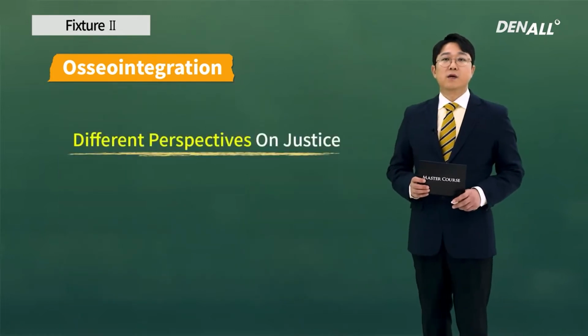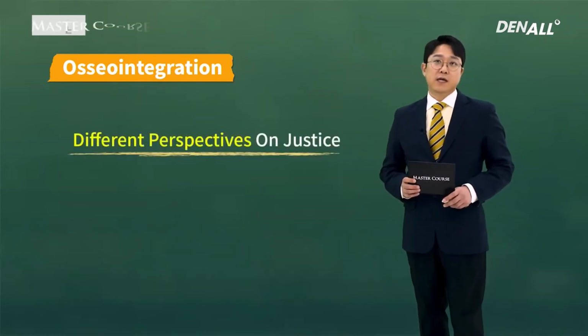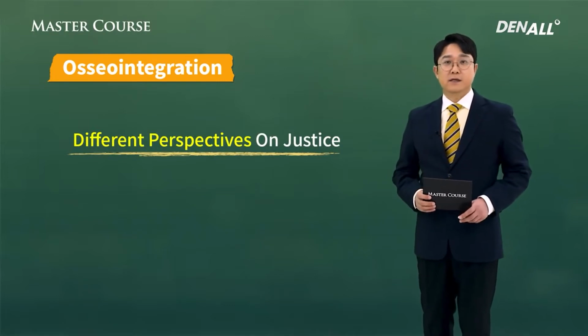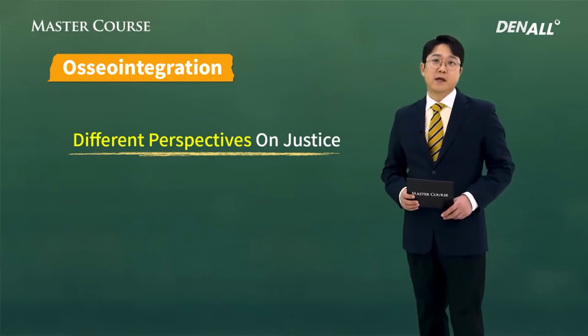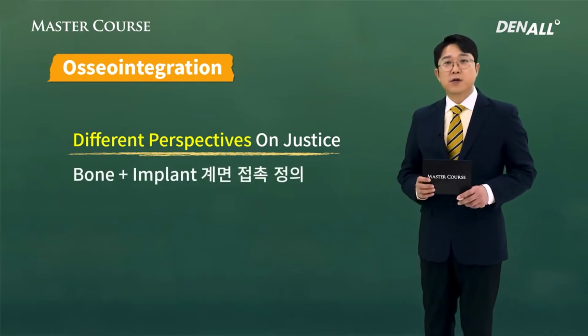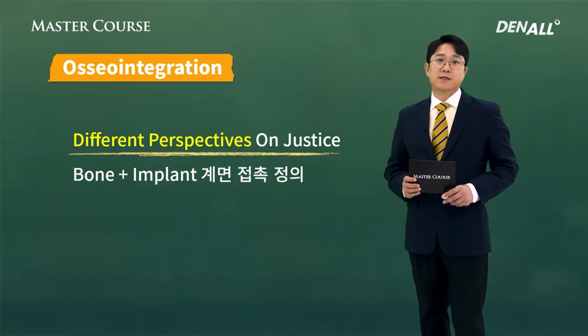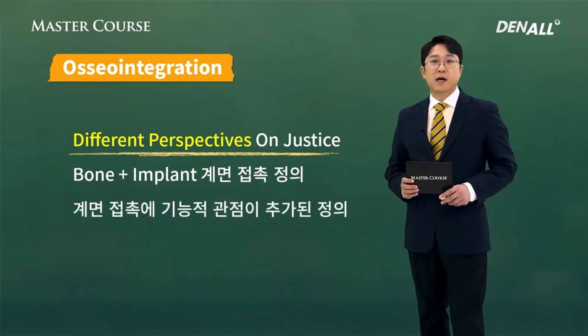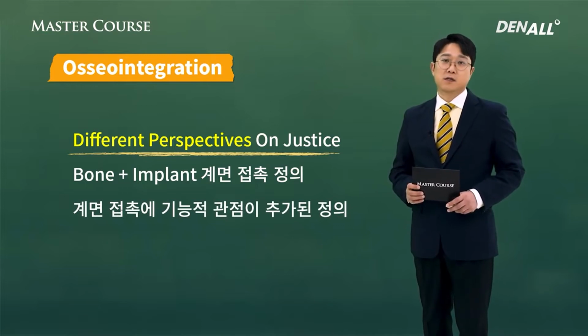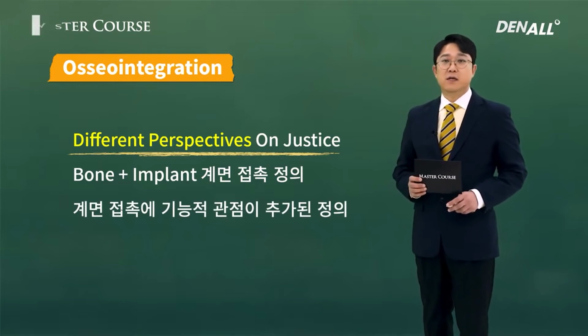Professor Brånemark defined the osseointegration. Since then, various definitions of osseointegration came out. Mostly, they were about the interface between bone and implant. There are functional definitions like by Jové, such as implants are strongly fixed and maintained in bone without symptoms during functioning.